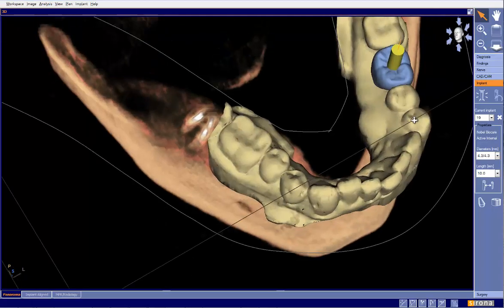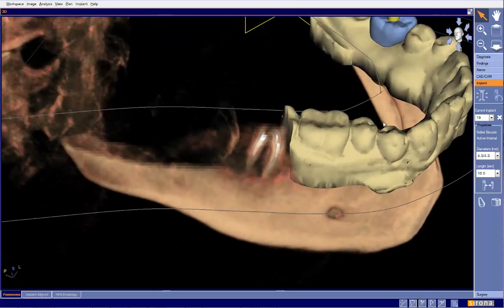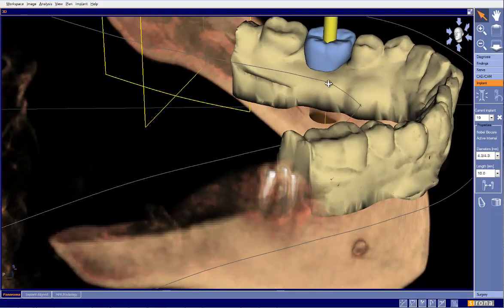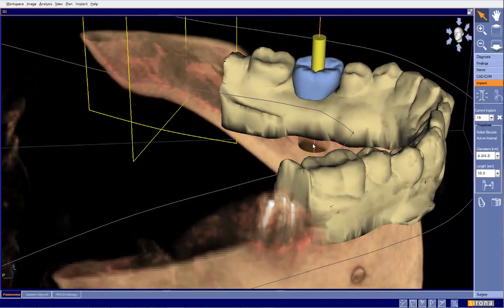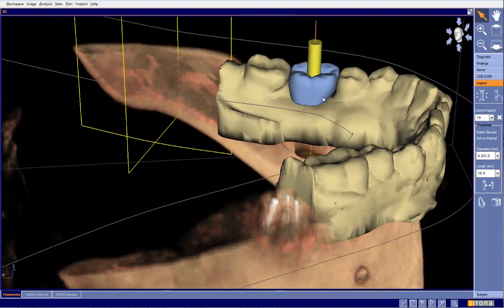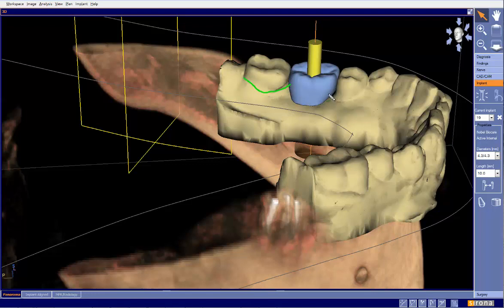One thing I did notice — and it's a pet peeve of mine — is the lingual margin drawing on both the lingual and the buccal. In green, that represents the existing gingival margins.